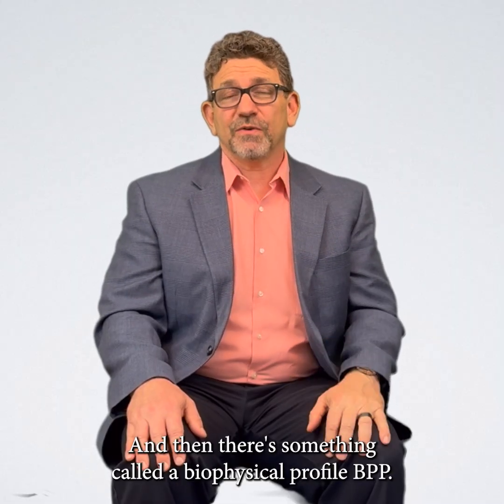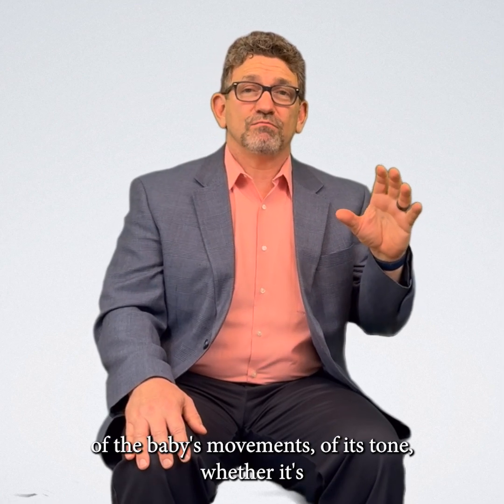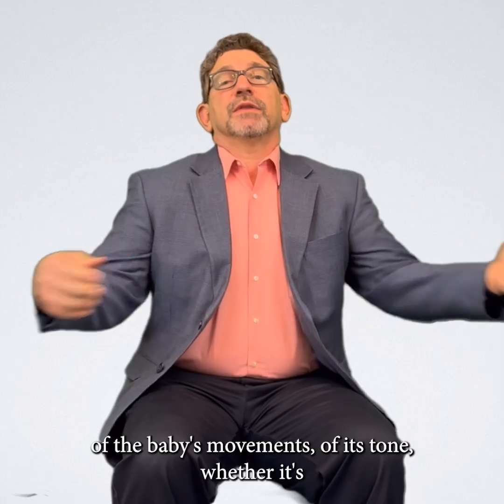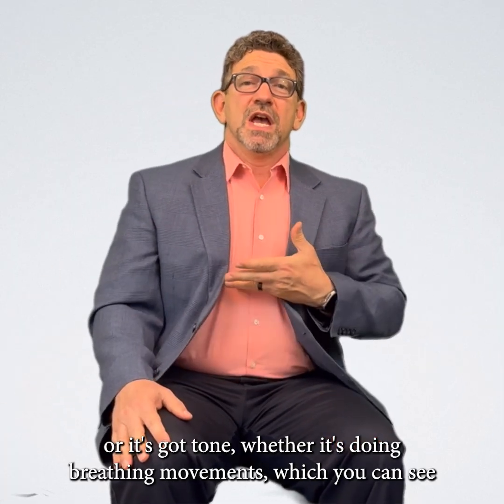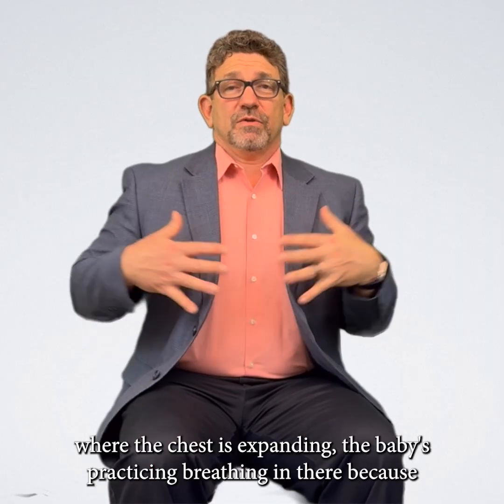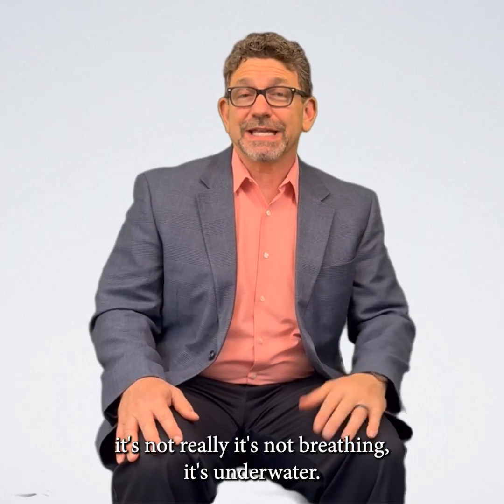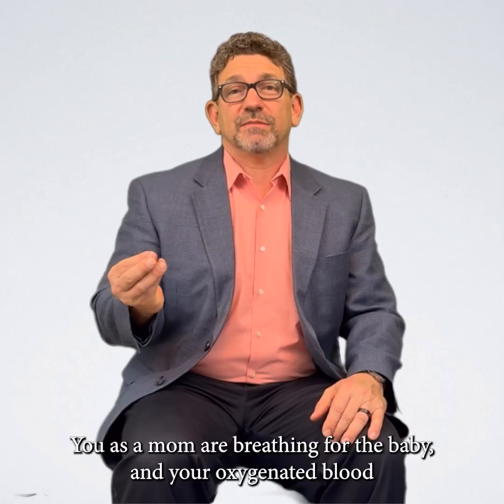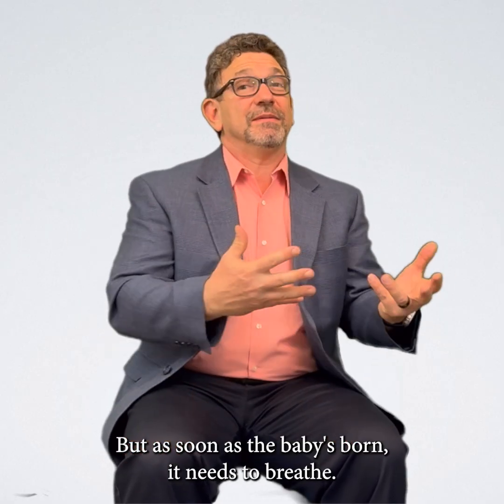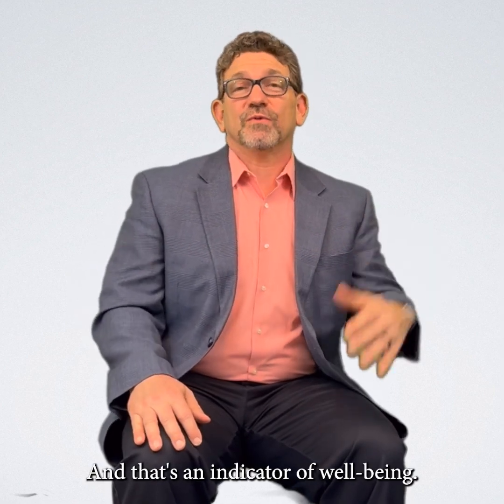And then there's something called a biophysical profile, BPP, and that includes ultrasound assessments of the baby's movements, of its tone, whether its arms are laid out, whether it has muscle tone, whether it's doing breathing movements, which you can see where the chest is expanding. The baby's practicing breathing in there because it's not breathing, it's underwater. You as the mom are breathing for the baby, and your oxygenated blood is going through the umbilical cord, but as soon as the baby's born, it needs to breathe, and so it's practicing developing those muscles, and that's an indicator of well-being.